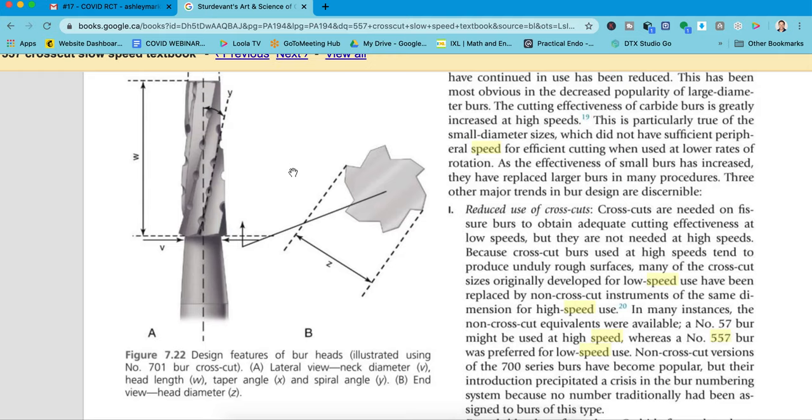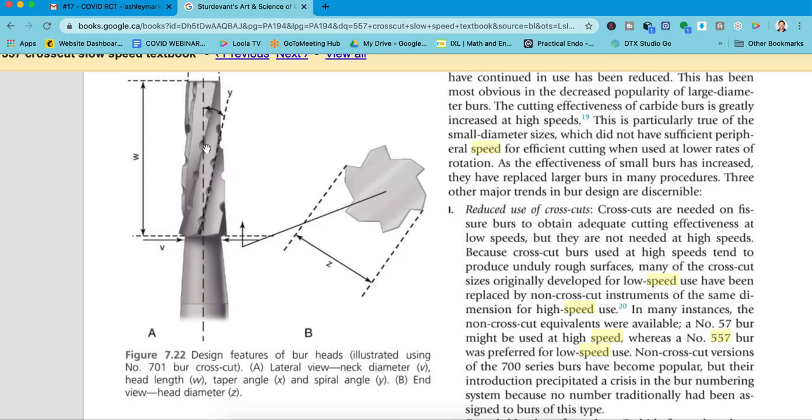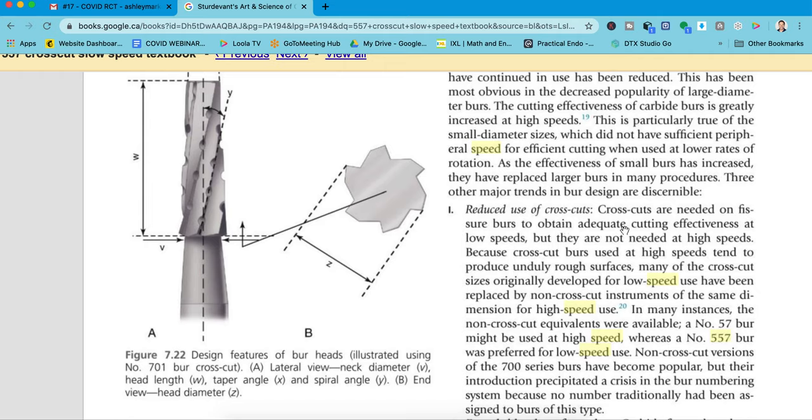So what am I talking about? Well, a crosscut burr actually has, so this is a 701 burr, we use a 557. It's a straight fissure burr or a tapered fissure burr, but it's got these little cuts in the blades. So that crosscut actually is developed to increase the efficiency. Crosscuts are needed on fissure burs to obtain adequate cutting effectiveness at slow speeds or low speeds, but they're not needed at high speeds.